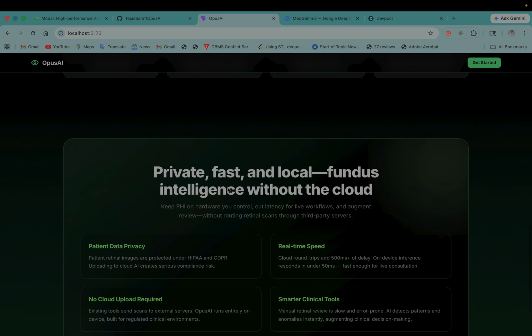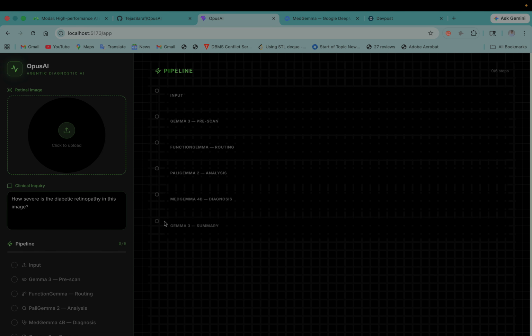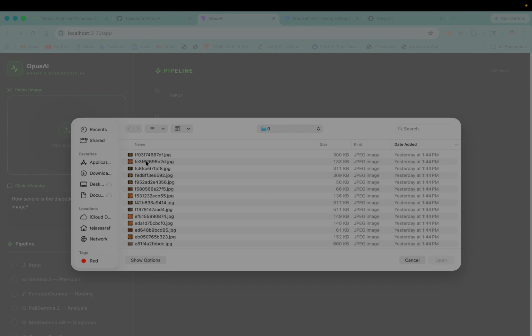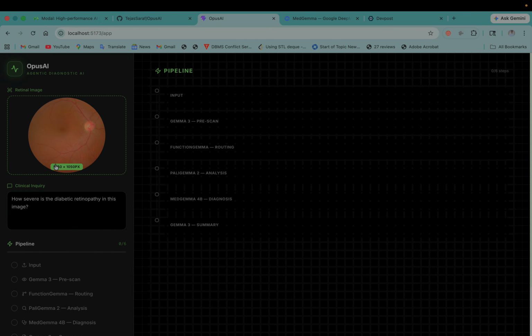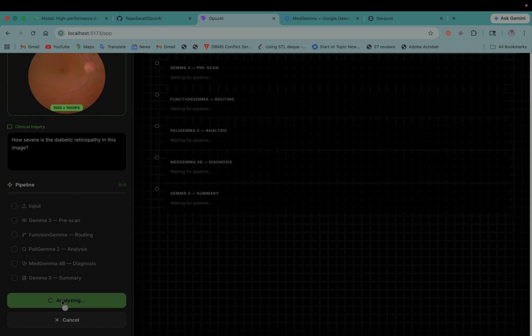Moving on to the tech part, we made a deliberate decision to stay focused. We are working specifically with color fundus photography, the kind used in diabetic retinopathy screening, glaucoma checks, and routine optic disc and macula exams.